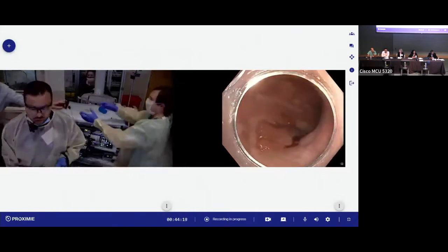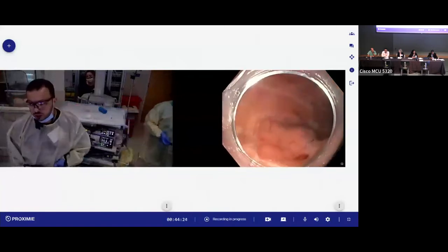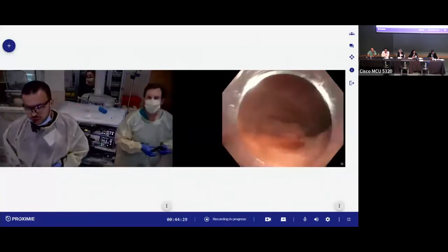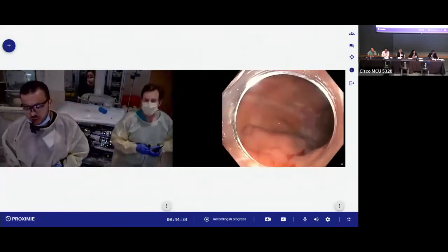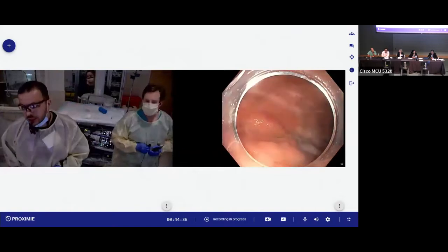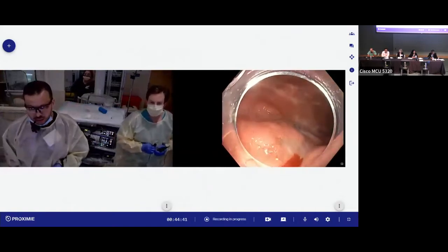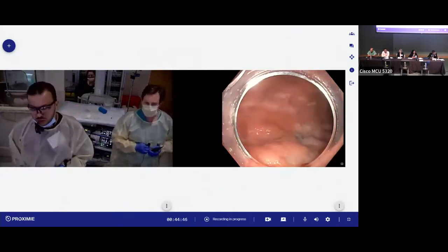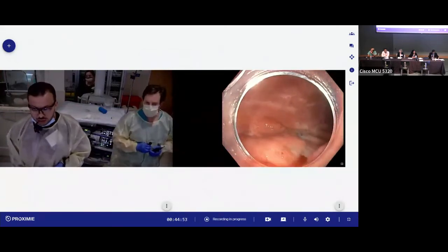Yes. We have this patient. We actually did a full colonoscopy before you guys were able to join us. And in the cecum, the report was a little bit not clear, but the cecum was actually clear. It may have been a small little polyp that was removed, but we did a high definition white light examination of the cecum as well as narrowband imaging examination of the whole cecum. We could not find any well demarcated or abnormal areas in the cecum. So we did not do anything.